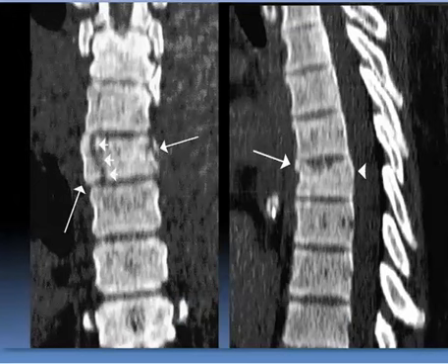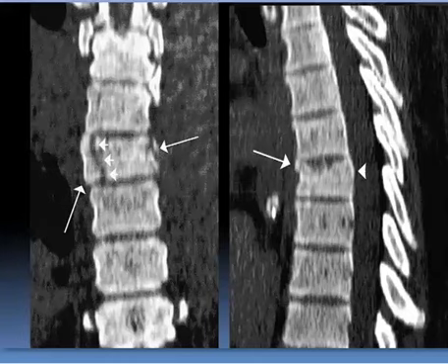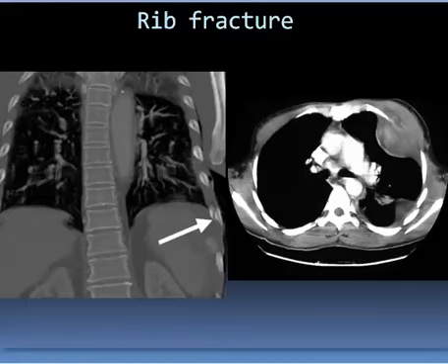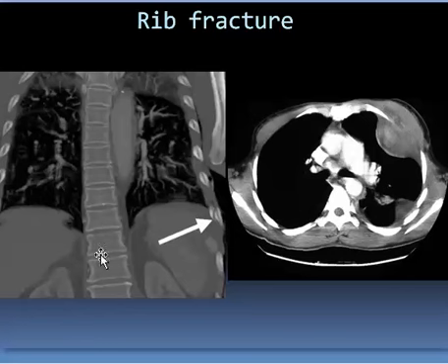This is coronal and sagittal reconstruction for a vertebral fracture — a compression fracture. And this is hematoma around the rib and lung contusion. Here in the bone window there is a fractured rib.